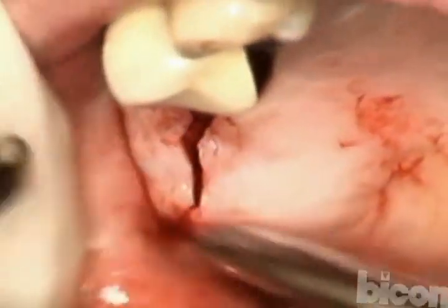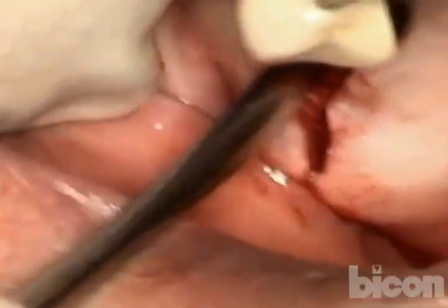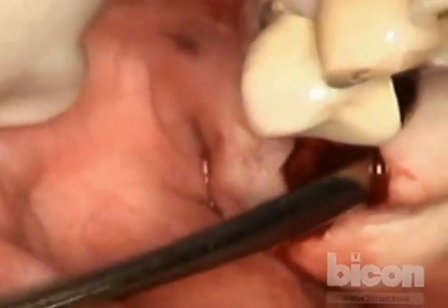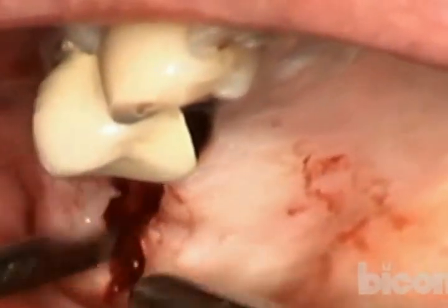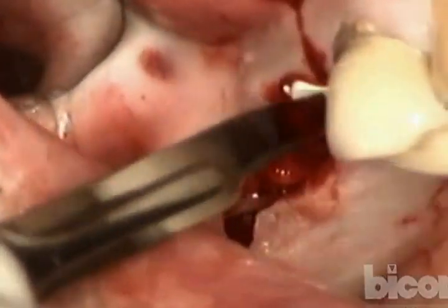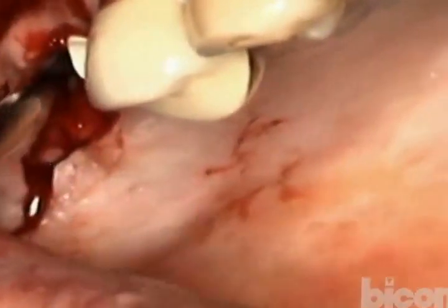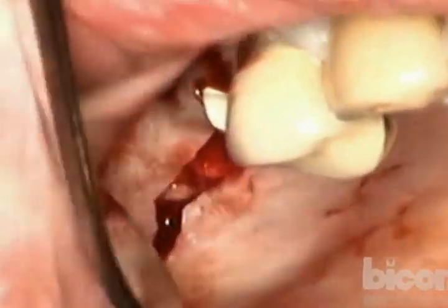And we'll just now finish up the flap. I may need to do more releasing incisions, but we won't do that until we know where we are. Suction here. As you all know, we need to keep our releasing incisions away from the surgical site and in an area that can be hidden, and that can be aesthetically acceptable, but at the same time gives us enough visibility. So suction here. Suction right there. Good.